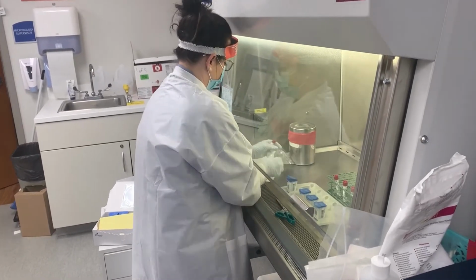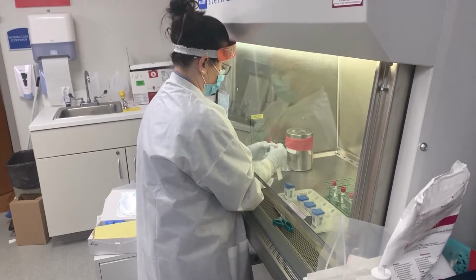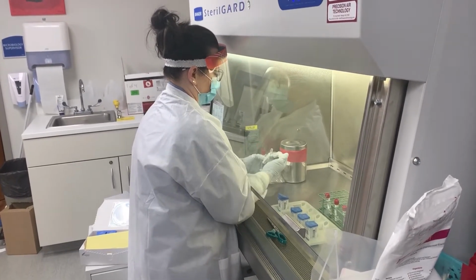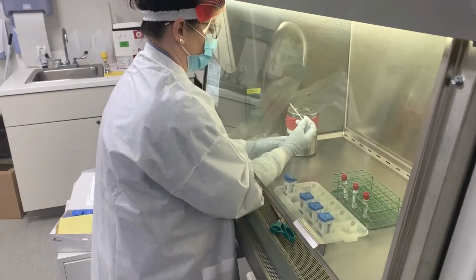She pops the top on the cartridge, then uses the pipette and sucks up a certain amount of viral transport media. After she does that, she will then place the liquid into a hole inside of the cartridge.